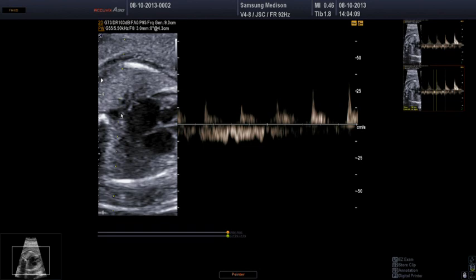And intraparenchymal, they run more or less together, so you can use the two of them in the same recording, which can be used not only to assess the pattern of the pulmonary venous Doppler signal, which may be abnormal in cases of hypoplastic left heart syndrome, for example, but also, in monitoring a fetus with anti-Ro antibody, you can measure the distance here between the beginning of atrial systole, which is this waveform, and the upstroke of the ventricular contraction, which is here.